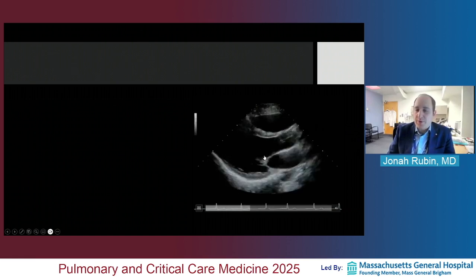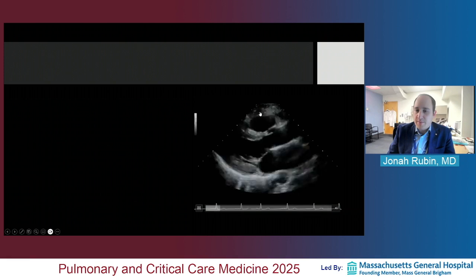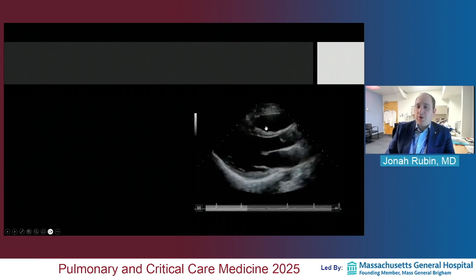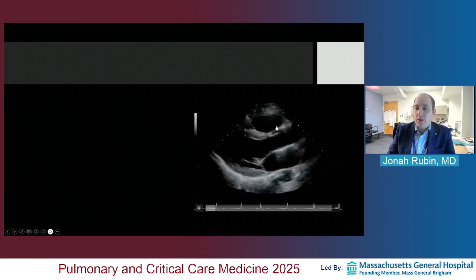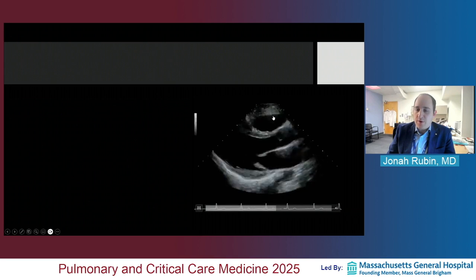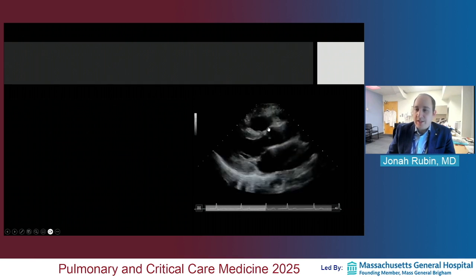That's one of your first opportunities to assess for severe MR. This is all you're seeing up here of the RV. What you can sometimes see in someone who has a severely dysfunctional RV is that this is extremely large. We have what's called the rule of thirds, where the RVOT should roughly be the same size as the LVOT, as the proximal aorta here, and should be the same size as the left atrium.